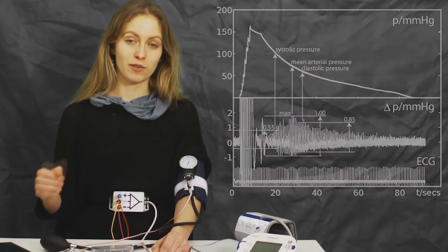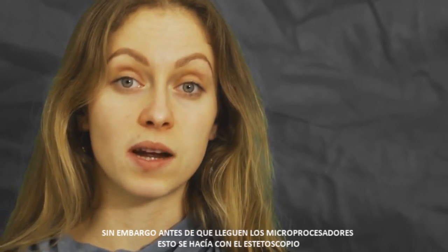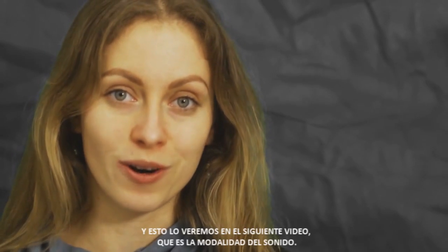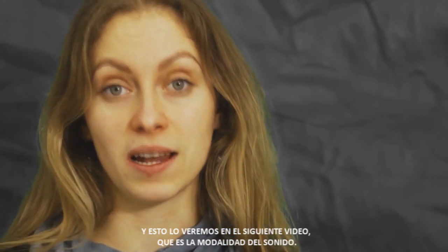However, before the arrival of microprocessors, this measurement was done with the help of a stethoscope, which brings us to the subject we shall explore in our next clip, and that is the modality of sound.